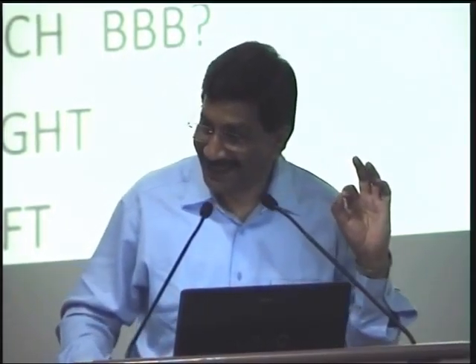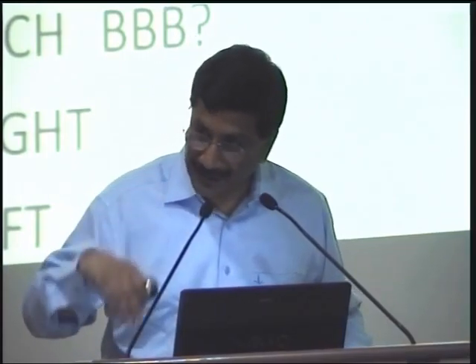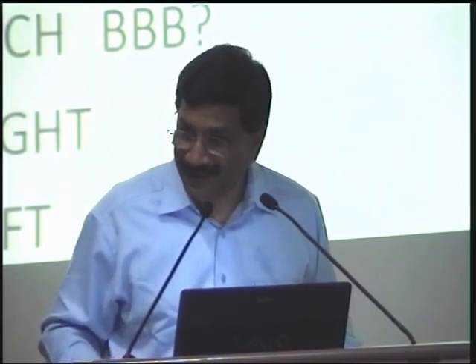So whenever there is a right bundle branch block, if secondary ST-T changes are not there, you must suspect associated coronary artery disease. It is a subtle sign of coronary disease. Although classical ST depression or ST elevation is not there, everybody will diagnose CAD when those are present, but you must diagnose CAD when all the other people are missing it. That's what you must always see. In ECG learning, we always say, obvious is obvious. Look for the inobvious.